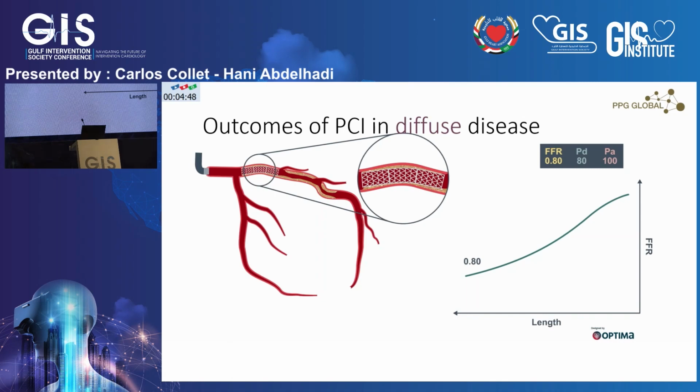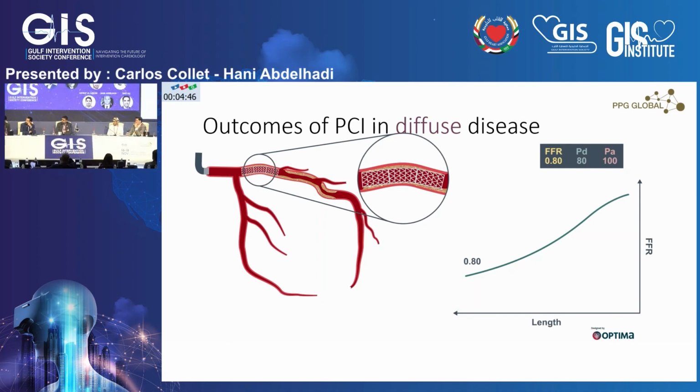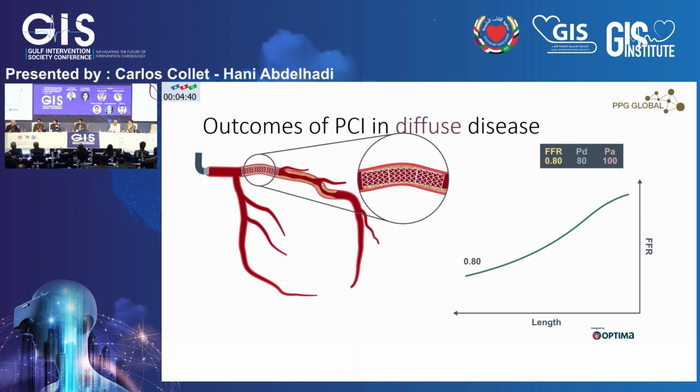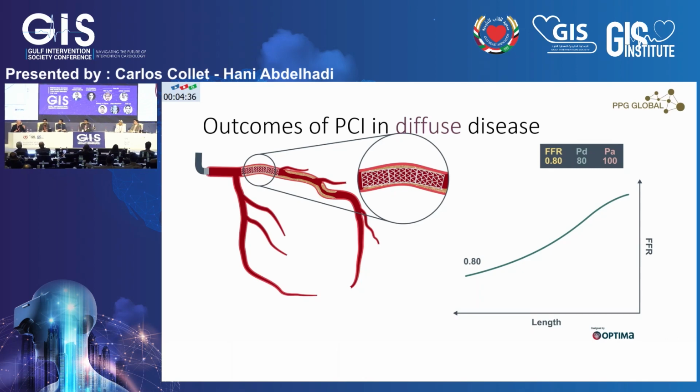We do this thing in our cath lab, is we take bets from everyone. What do you think the FFR or the IFR is going to be before you do it? And sometimes you can't guess. Sometimes you can swear you're going to stent the vessel and it's negative. So I think it's very important to know physiologically before you go anatomically.